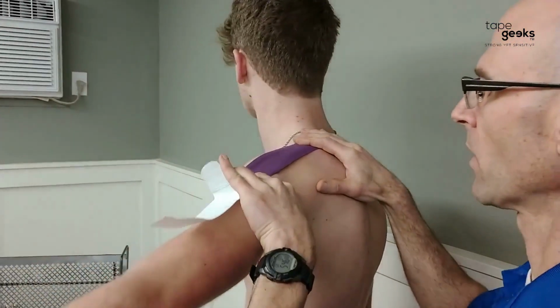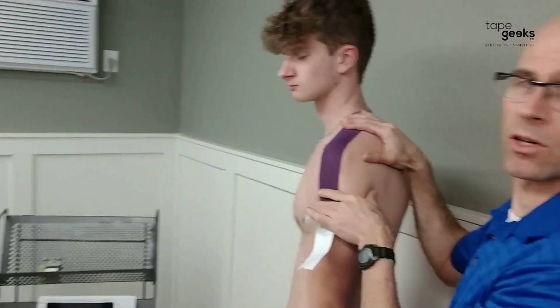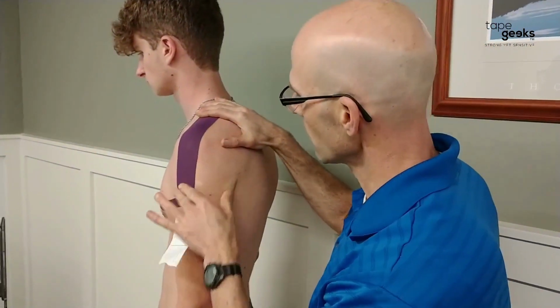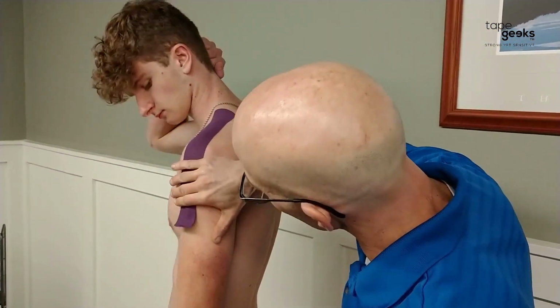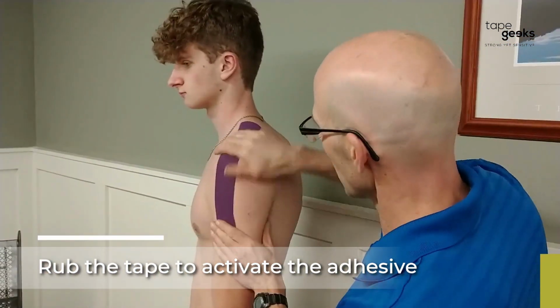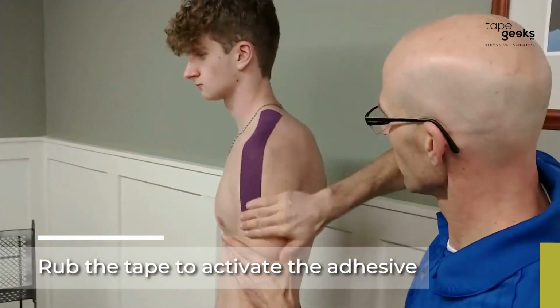Now we'll go ahead and bring your arm down. And that puts a little more tension on it when he brings his arm down, because it lengthens it. Now I held it here at the base, and I'm laying this one down with no tension. You want to rub it on to activate the adhesive.